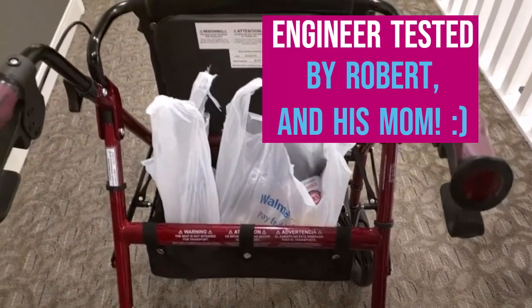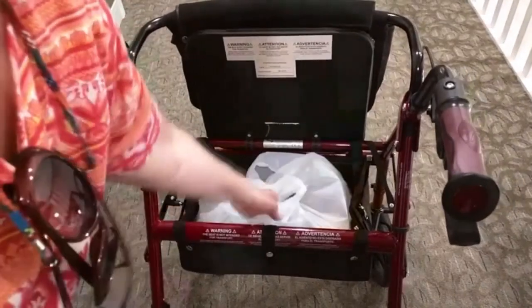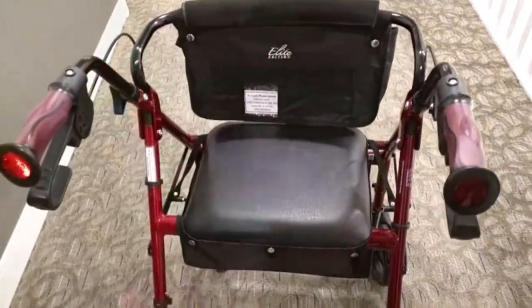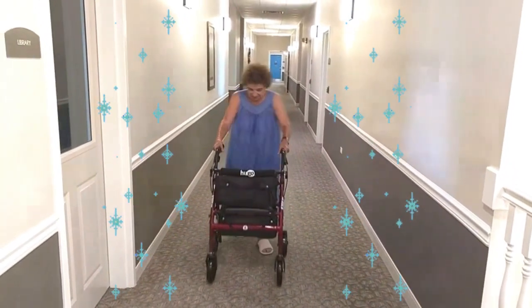Hello again, this is Robert Veach here and this is my video review of the Hugo Mobility brand. This is their Elite Rollator Walker with seat saddlebag. It's in garnet red.